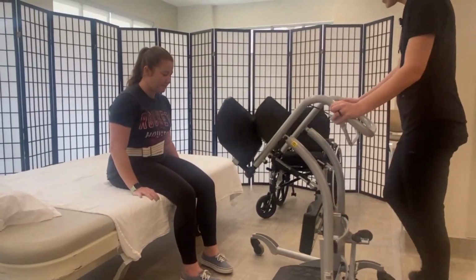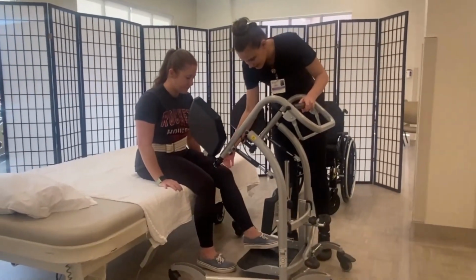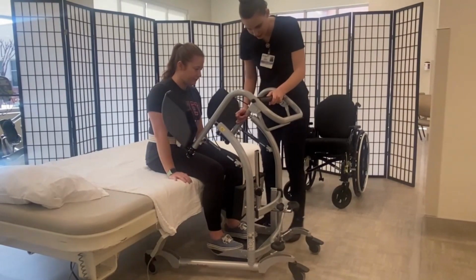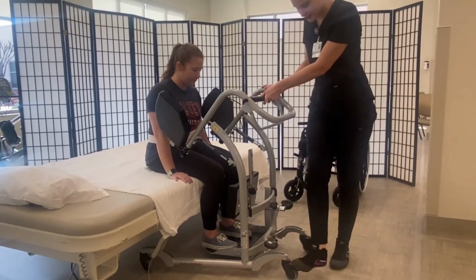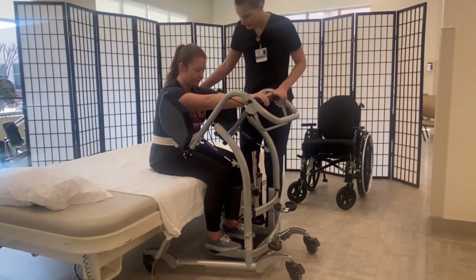To use the manual lift, a patient is assisted on sitting at the edge of the surface that they are on, and the lift is guided in front of them as their feet are placed on the foot plates of the lift. Manual lifts have locks for safety once it is in place.